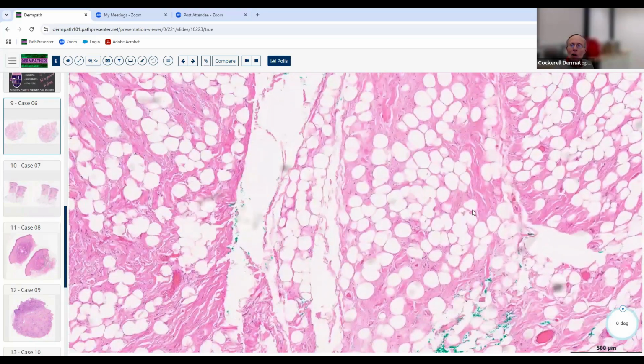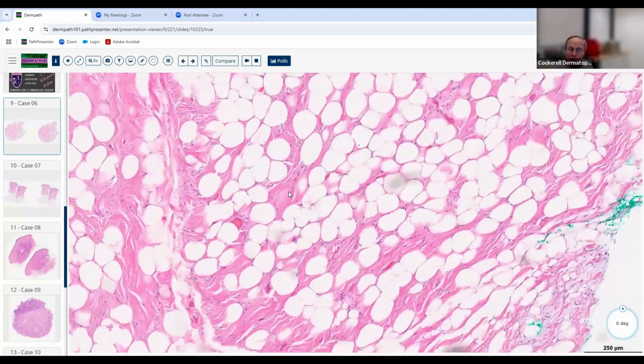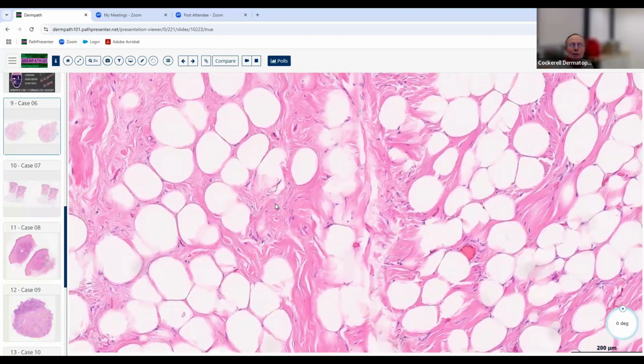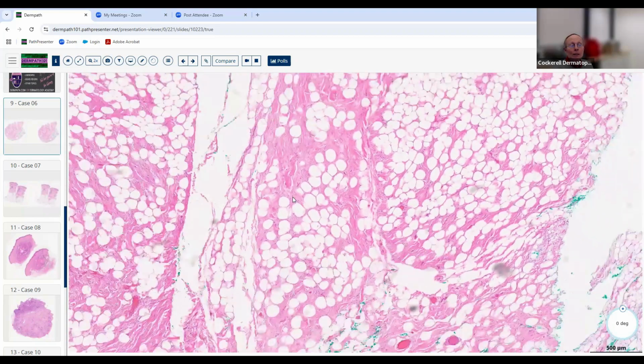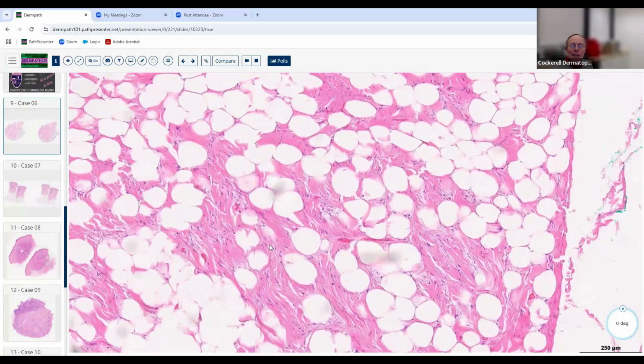If we look at it and we see these large bizarre cells that look like little flowers, florets, that's known as a pleomorphic lipoma. That's getting a little bit more esoteric and probably not going to be asked about. Here we've got a lot of fibrous tissue, lots of fibrous tissue. And if we see a lot of fibrous tissue plus a lipoma, guess what the diagnosis is here? A fibrolipoma. So it's yet another example of a lipoma. Again, maybe slightly esoteric, but it's pretty obvious here.